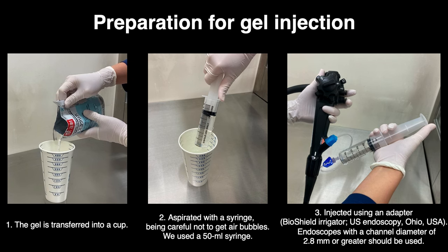The gel is transferred into a cup and aspirated with a syringe, being careful not to introduce air bubbles. We used a 50ml syringe and injected it using an adapter. Endoscopes with a channel diameter of 2.8mm or greater should be used.